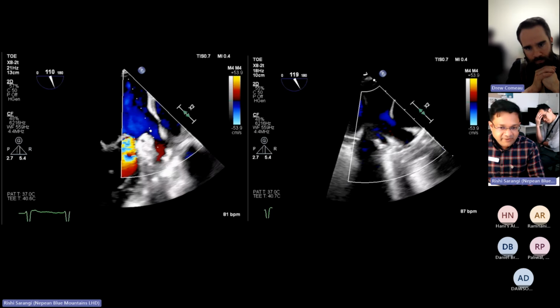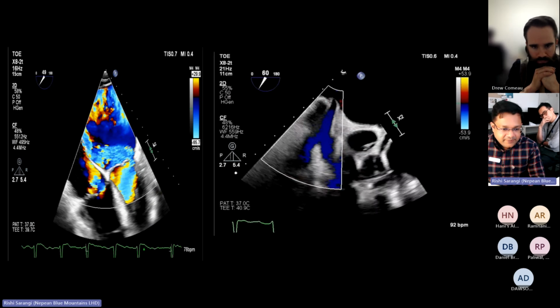Looking at left pulmonary veins, and these are the right pulmonary veins I'm looking at. The reason why I put this screenshot is the direction of the jet, an anteriorly directed jet. So this is the right pulmonary veins, which I'll be looking at here. This is where I'm hoping to get the best reversal. The left pulmonary veins may not have reversal. So let's see what happens in this case.